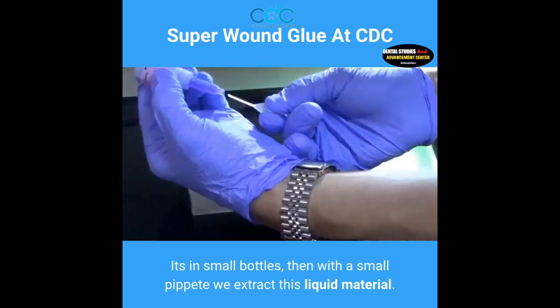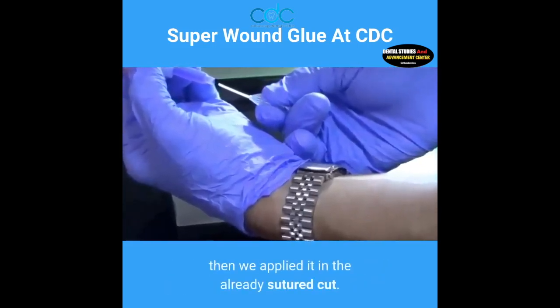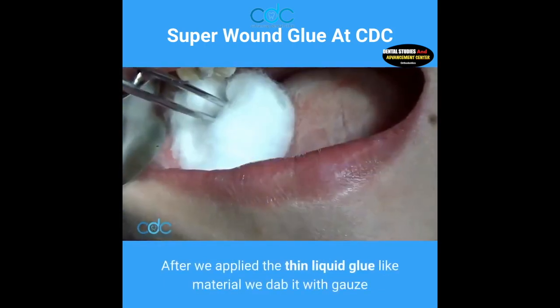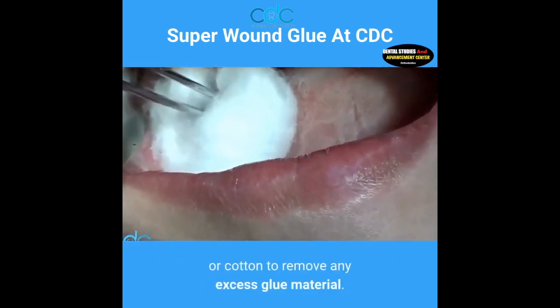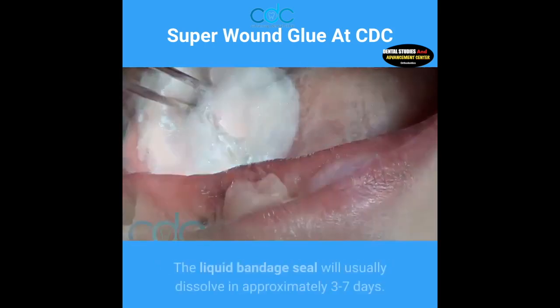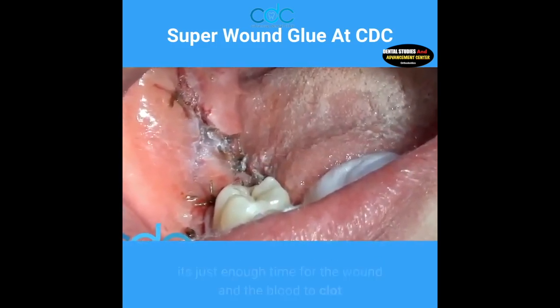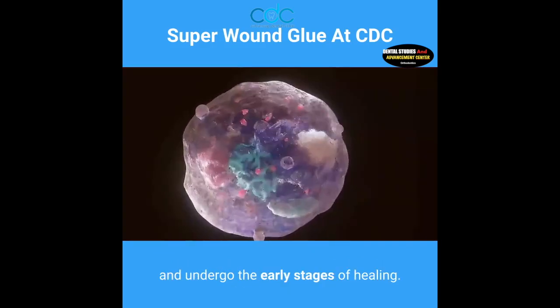It's in small bottles, then with a small pipette we extract this liquid material. Then we apply it to the already sutured cut. After we apply the thin liquid glue-like material, we dab it with gauze or cotton to remove any excess glue material. The liquid bandage seal will usually dissolve in approximately 3 to 7 days. It's just enough time for the wound and the blood to clot and undergo the early stages of healing.